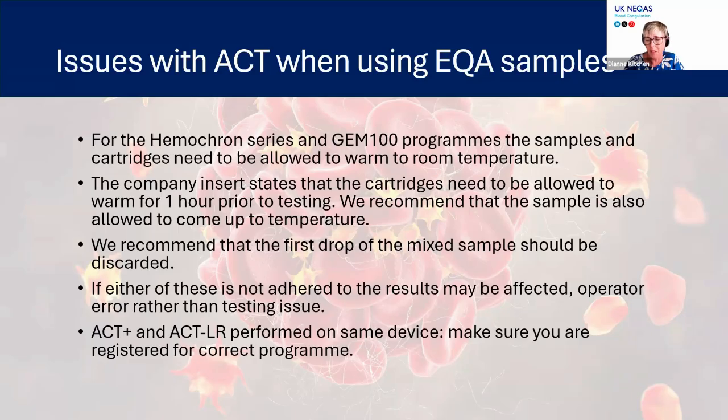Once it's been mixed, we recommend that you discard the first drop, because there might be some caught in the cap that's not properly mixed. And if people don't stick to these, it can affect the results and give you an operator error type result.